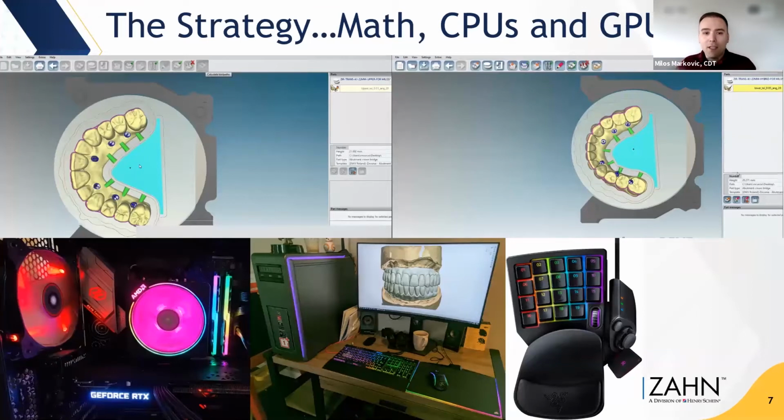You want to make sure that you have a good setup, a good ergonomic chair. A tool that you see here is from Razer that actually helps you put all your shortcuts on your computer, so you work very efficiently, so that you're ergonomically placing your hands. And also, you want to make sure you use blue light filter glasses. So these are all the new tools. Think of it as investing in a set of porcelain brushes or really good hand pieces back in the day.